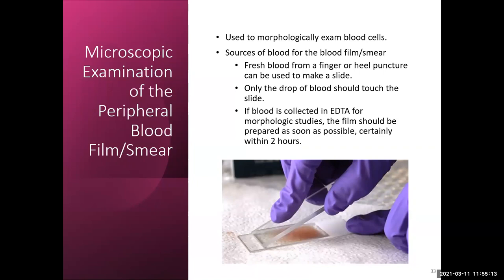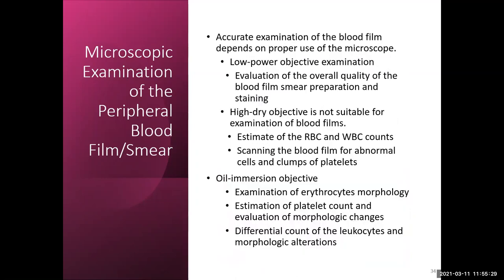Making the slide you will do in hematology too, so you'll get some practice doing that. You'll make a lot of slides in your career, so that's a technique that you'll have to tweak, and you'll get to work on that in hematology. So looking at a blood smear, you're going to start off on low power, and you'll get to practice this in a couple weeks. When you're looking at low power, you're looking to see the overall quality of the slide. You're looking at the feathered edge to see if there are any platelet clumps, any parasites, and basically to find where you're going to start doing your differential count.